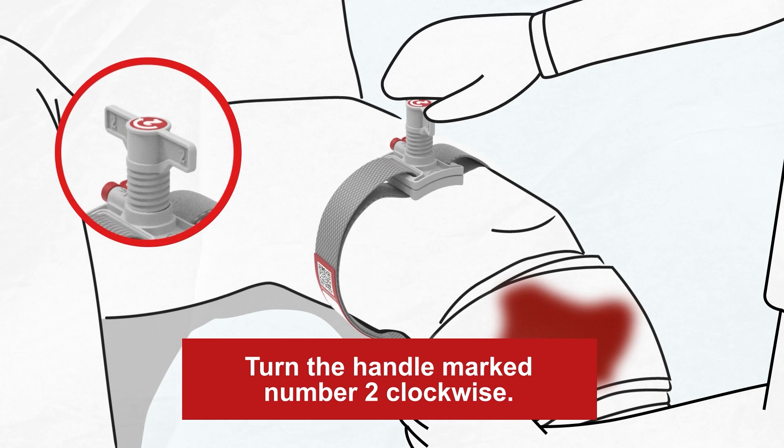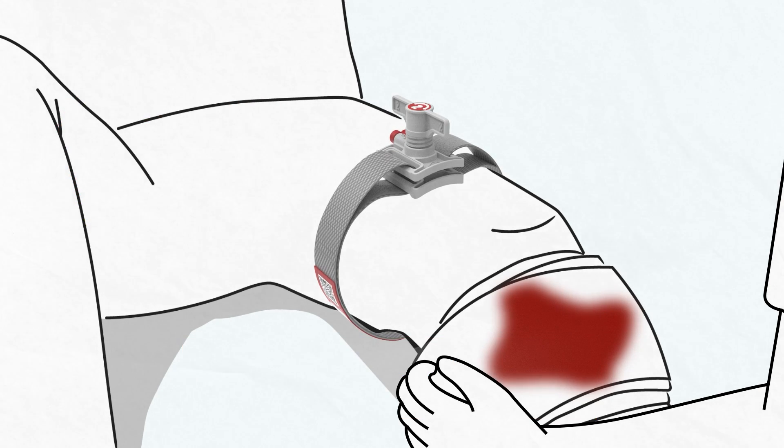Step 2. Turn the handle clockwise until the bleeding stops.